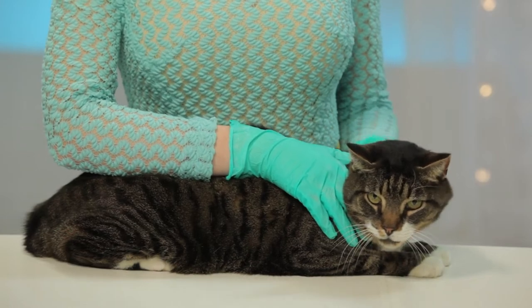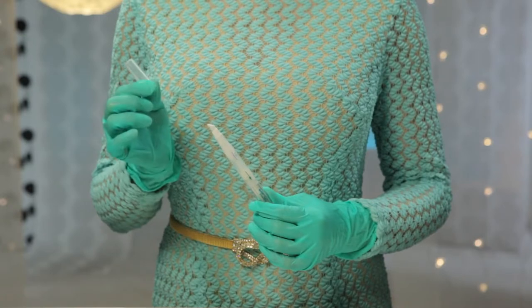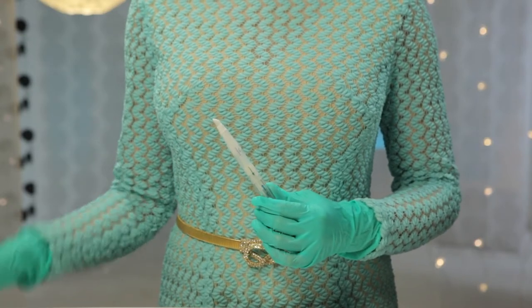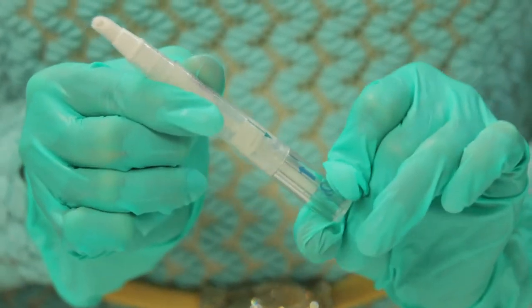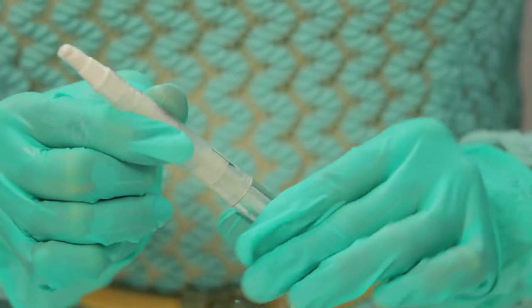First, put on protective gloves so you don't touch the medicine. This protects you, the medicine, and your cat. Before you use the Twisted Dose applicator for the first time, you must prime it like a pump. First, remove the protective cap that covers the white top of the applicator. Now twist the end of the applicator until a small amount of gel forms evenly at the tip. This may take several rotations.